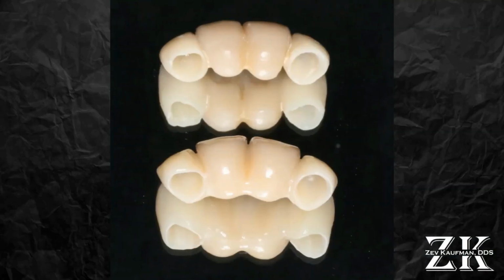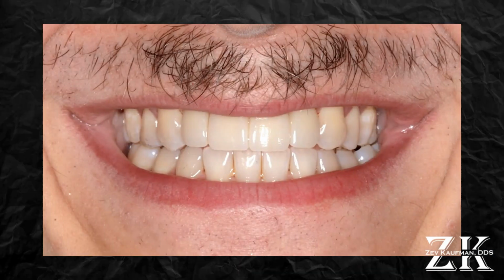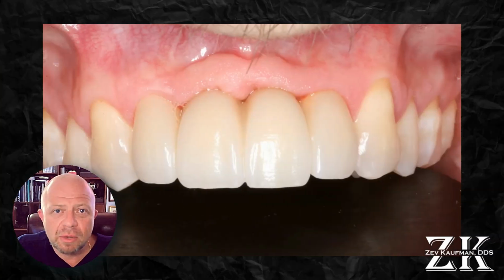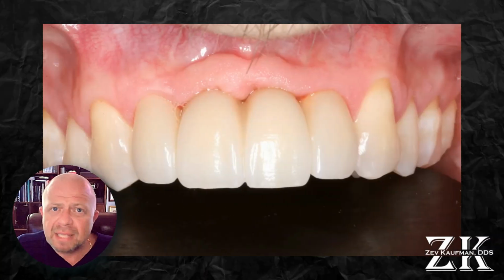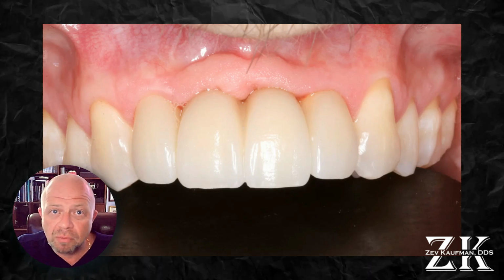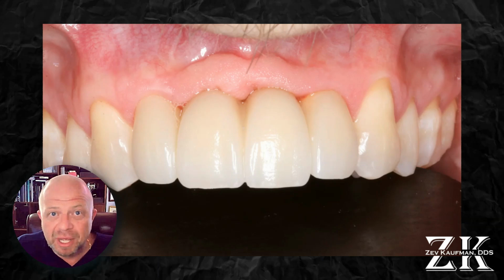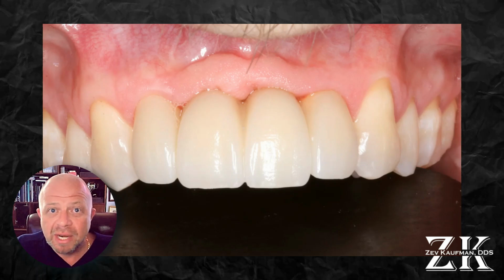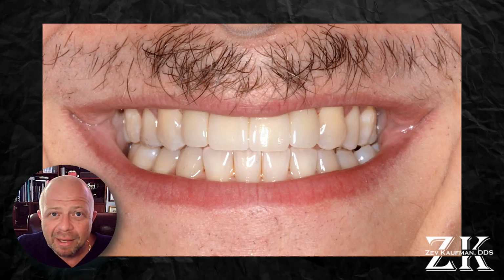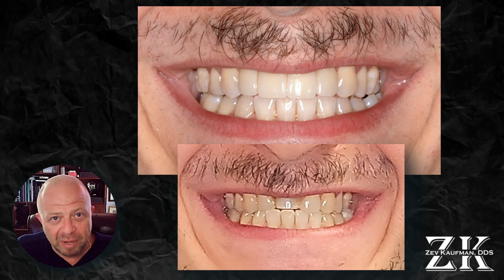And this is the other view from the tongue side. And here's the final in place. Our patient was very, very happy. Wouldn't you be? As you can see, we got beautiful gum contours. Yes, I'd love to have them perfect, but I'm not God, but I can create a beautiful environment that he can clean. And if he ever wants to put a floss underneath, it'll flow right through on those nice round surfaces. And of course, the obligatory smile. So much better. And a simple procedure, a bridge with ovate pontics.